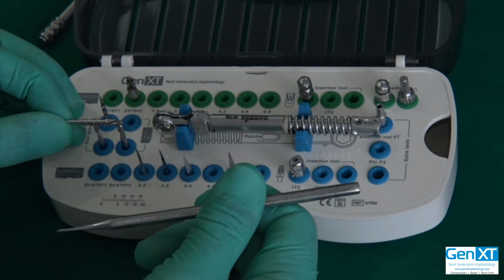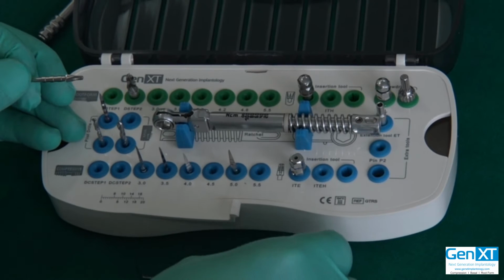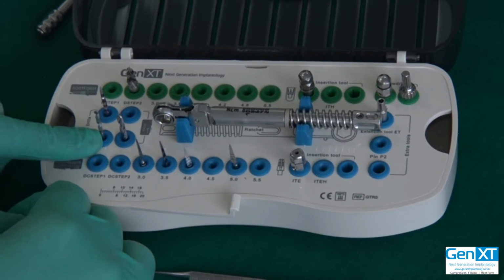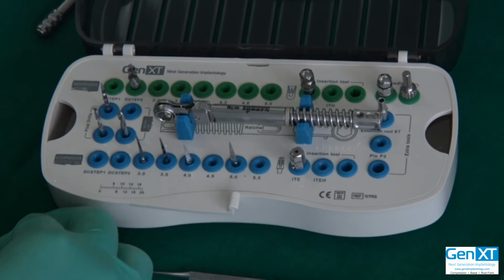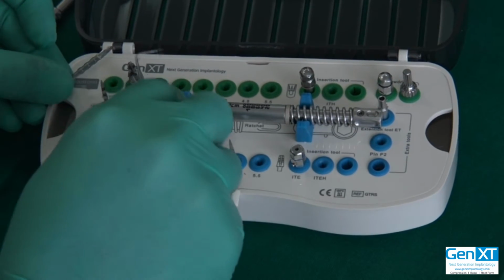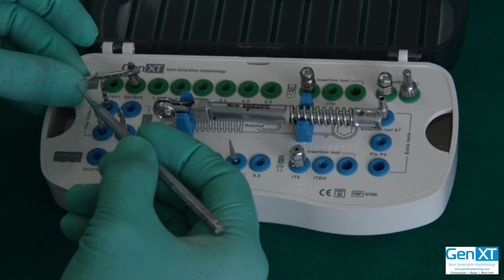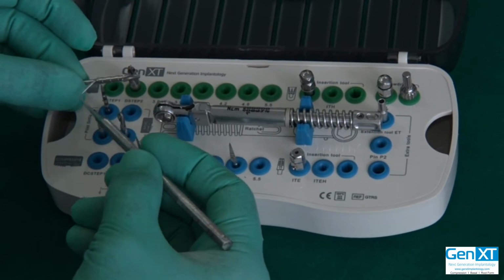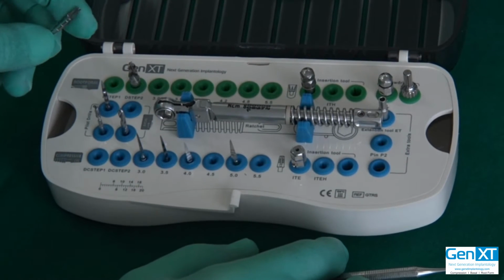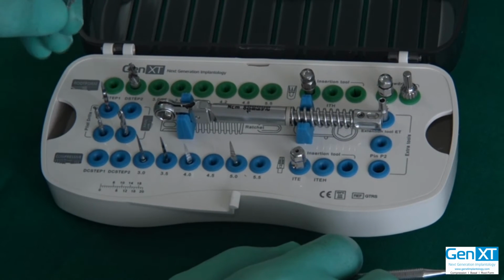If you are placing a 3.0 millimeter compression root form implant, all the drills you need to do are the precision and the pilot. From the 3.5 implant onwards, you will need to use these 2 additional drills. You will need to use this drill first up to the full depth. After using this drill up to the full depth, it's possible to place the 3.5 millimeter diameter root form implant.